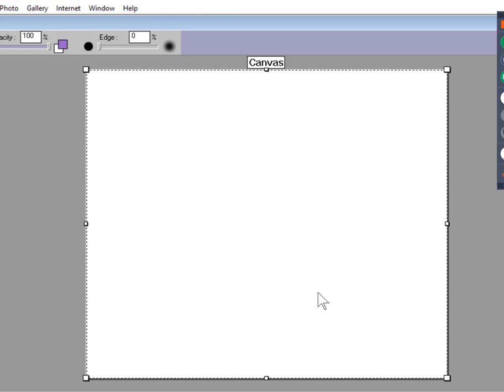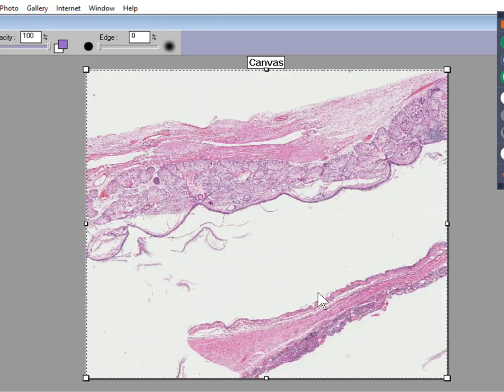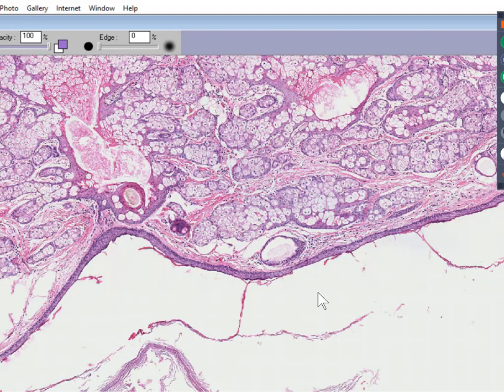And you're going to say, oh, Monastic must be crazy. He told us he's going to show us an ovarian tumor, and that stupid idiot is showing us hair and epidermis and sebaceous glands.